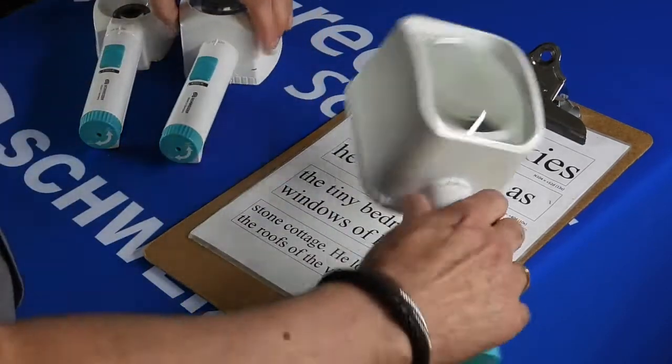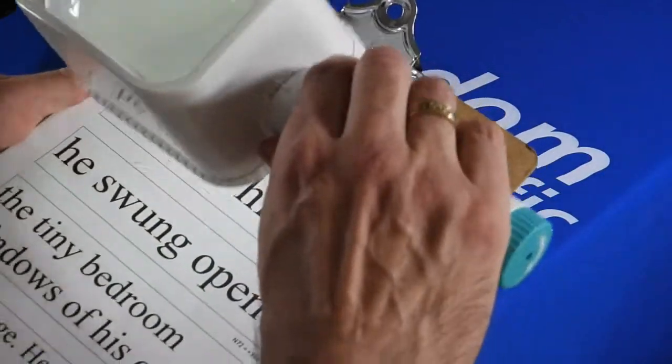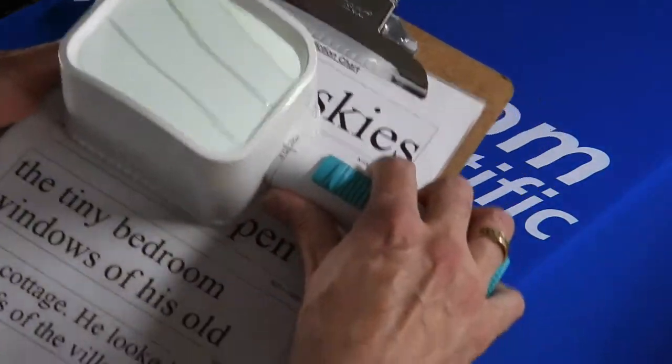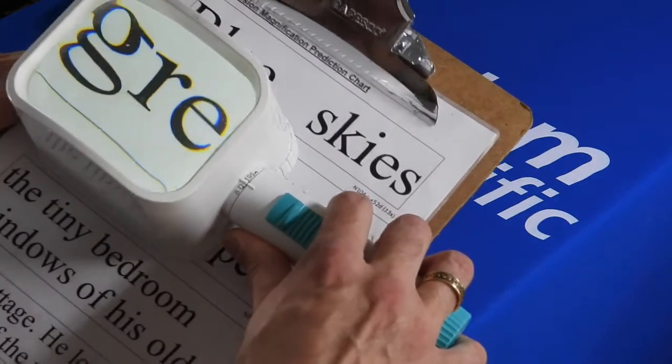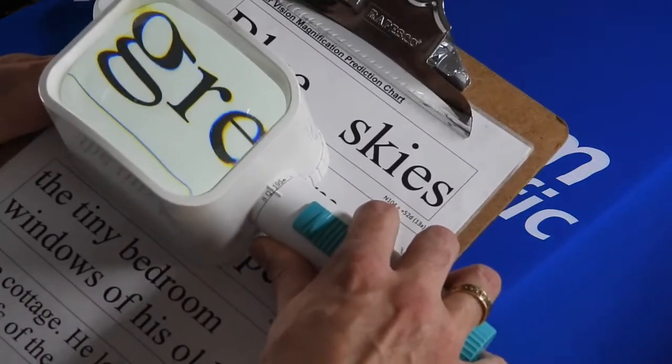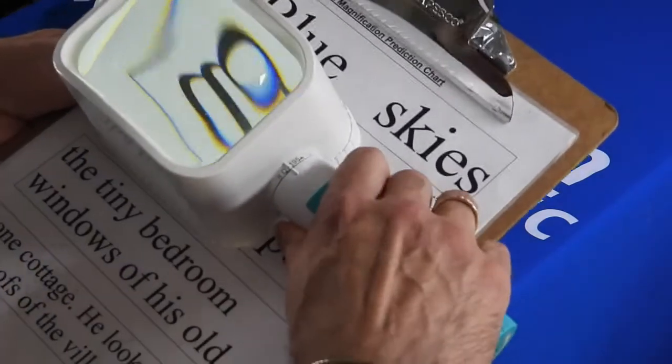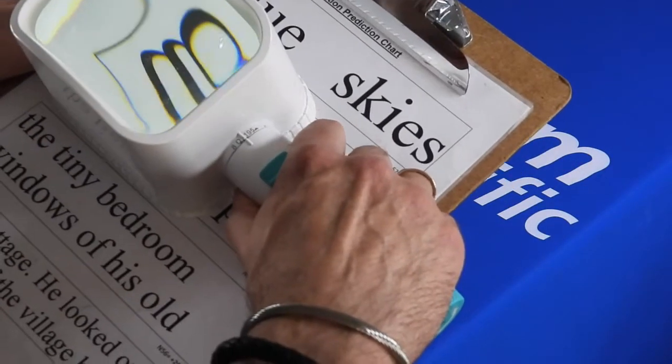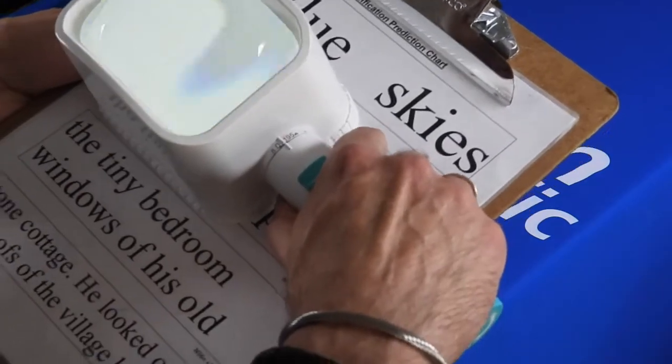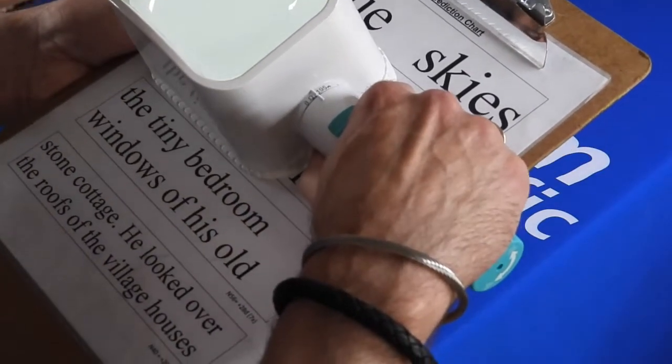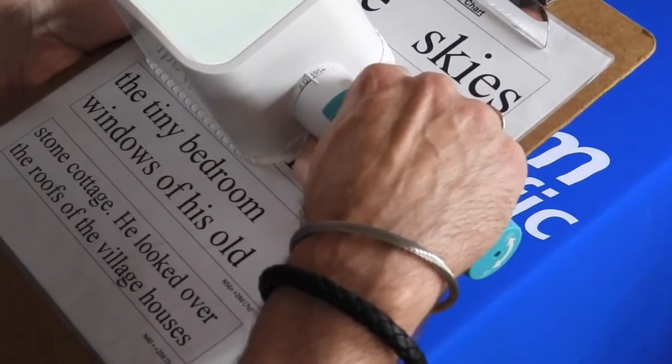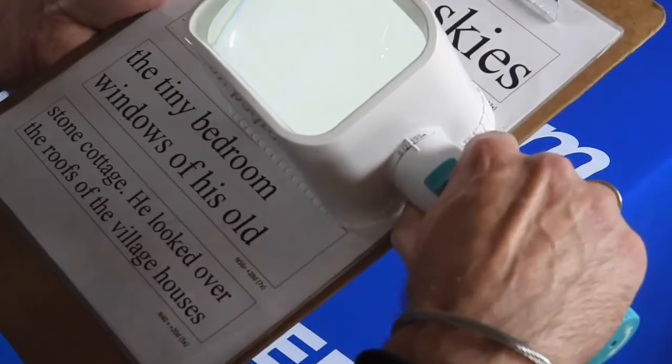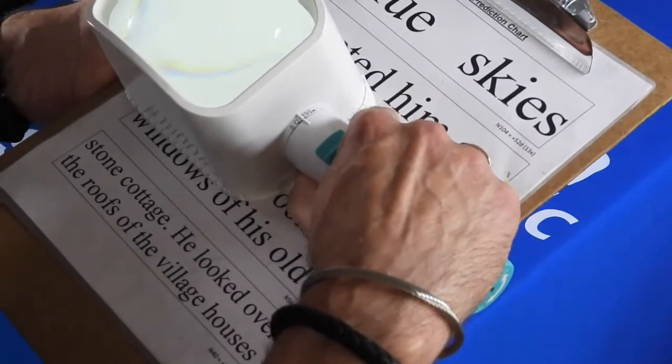With the stand magnifier, one of the benefits is that once you place it on the reading material, it is already at the correct focal distance, so you don't have to worry about getting this at the right height. The only thing you need to do is to move your head and your vision closer to the lens to be able to read it.